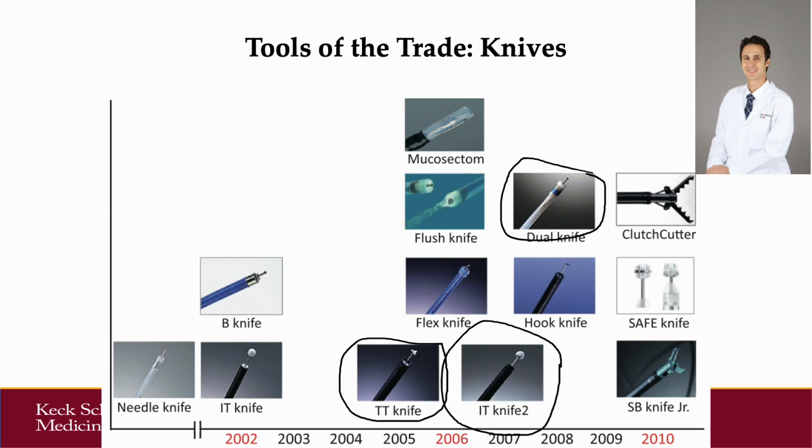There are also knives that have a scissor-like function, and these can also be useful for submucosal dissection, especially in situations where there is significant vascularity, as you can coagulate and cut at the same time. These knives often are also used for Zenker's diverticulotomy.